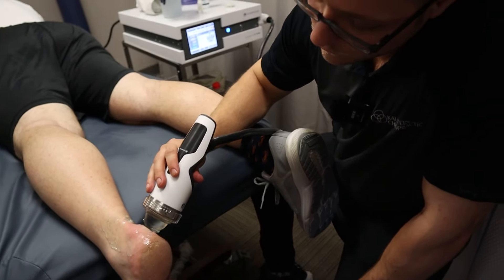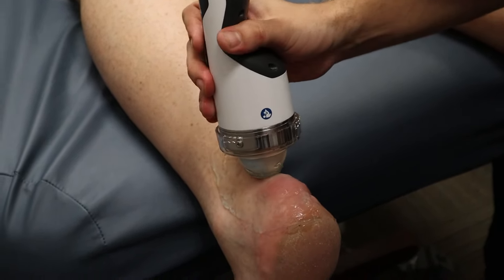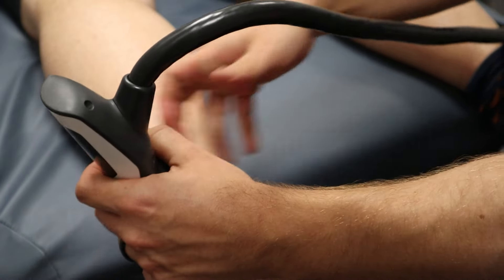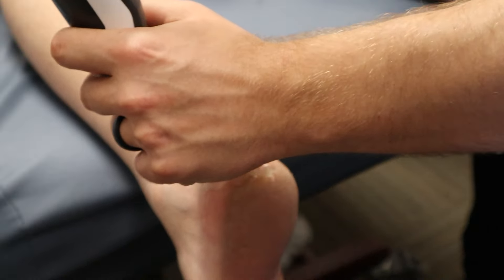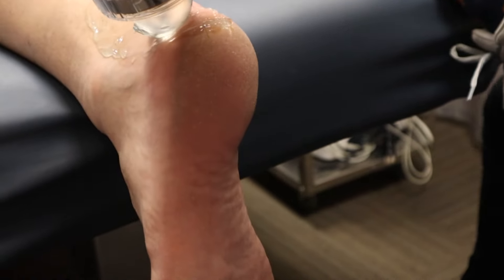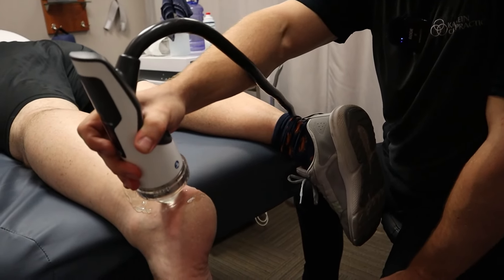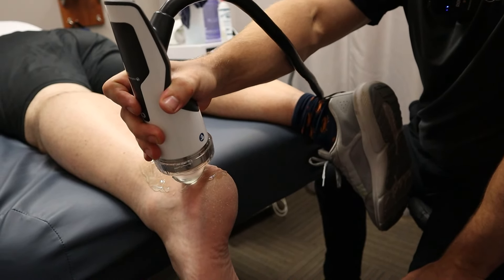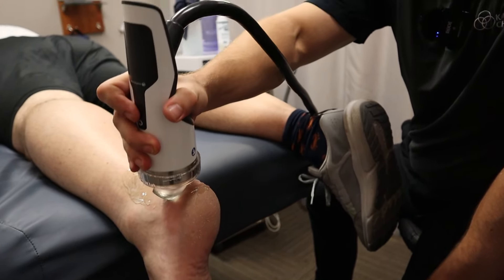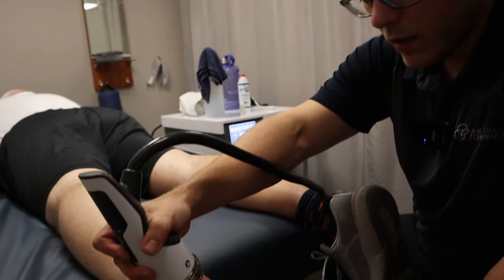Now, has any area we've hit so far been a little more tender than the others, or is it all feeling pretty good? Okay, point one of those spots out to me — perfect. So what we're finding is that the edges, up in here and up in here, are really the sensitive spots. For the rest of the treatment I'm going to focus right here, and on the other side we might manipulate the angle, slightly turning the handle piece, but for the most part we're going to stick right here.